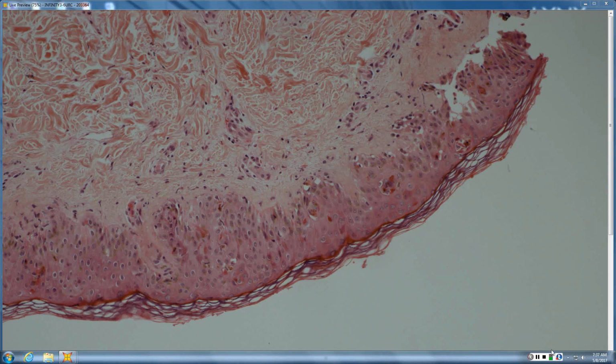Incontinentia pigmenti, you'd expect the collagen to be finer and brighter red because it would probably be kid skin. In the verrucous phase, you can have all the dead reds, but again, you don't have the vacuolar interface, and you may or may not have eosinophils still present.